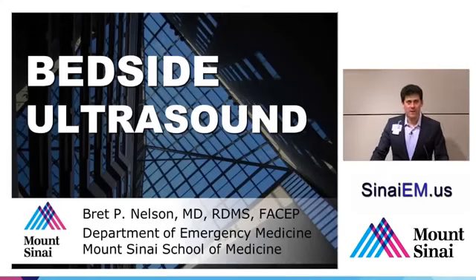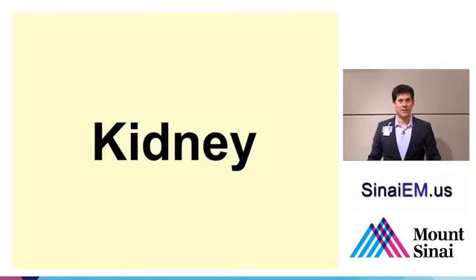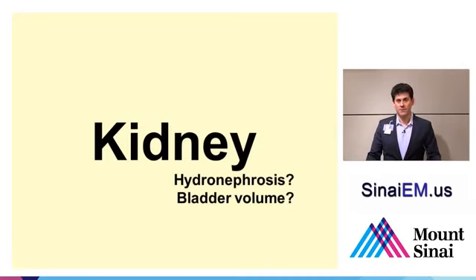Okay. My name is Brett Nelson from the Department of Emergency Medicine at Mount Sinai Hospital, and we're going to be speaking about point-of-care ultrasound today, specifically looking at the kidney. Major questions that we think about for the kidney in terms of point-of-care ultrasound are going to be assessing for hydronephrosis and looking at bladder volume.